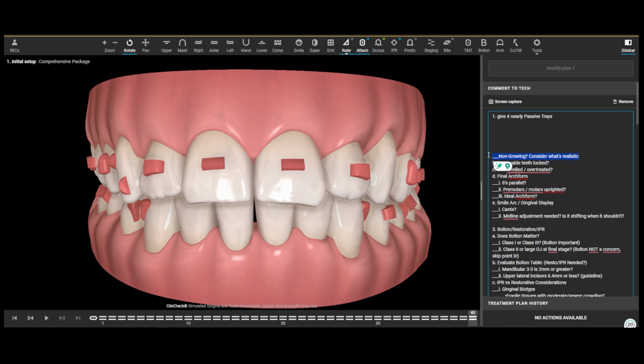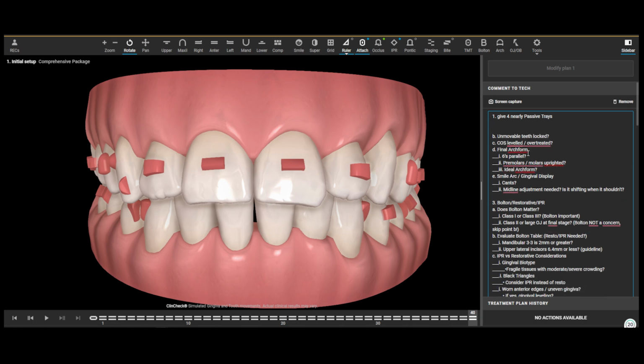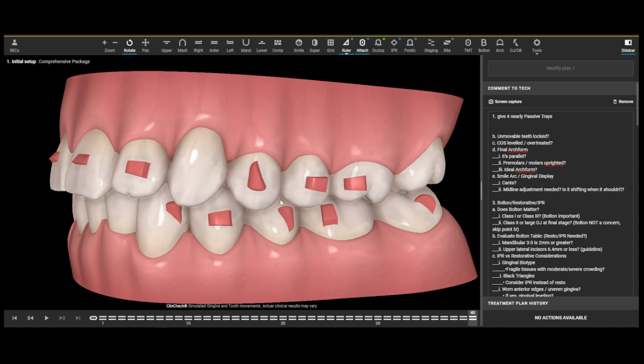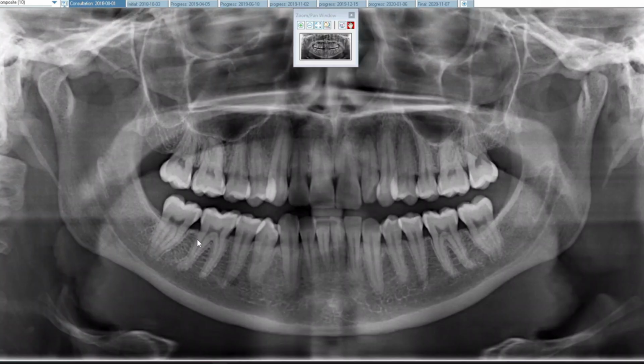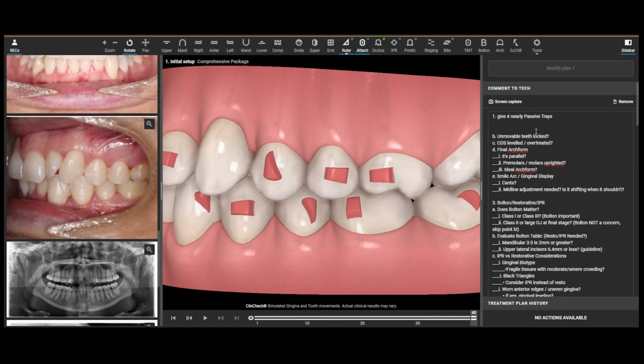The next one was, if they're not growing, consider what's realistic. How much change can you make with elastics or anterior posterior adjustments? In this consideration, again, nothing needs to change because they're pretty much in the right spot. The next thing I'd look at is, are any unmovable teeth moving? So let's go ahead and take a look at our x-ray here. No implants, no crowns, nothing crazy going on. So there's no reason that anything can't move. So we don't need to lock any teeth.